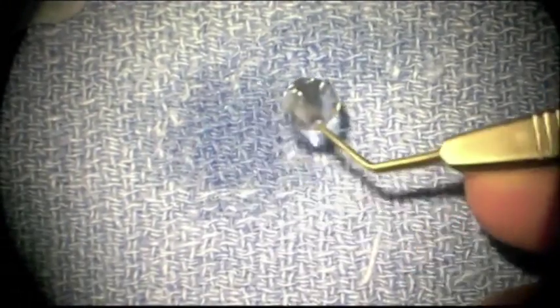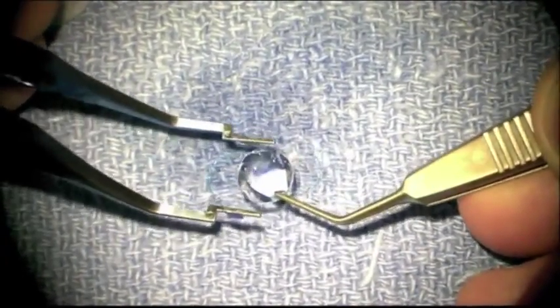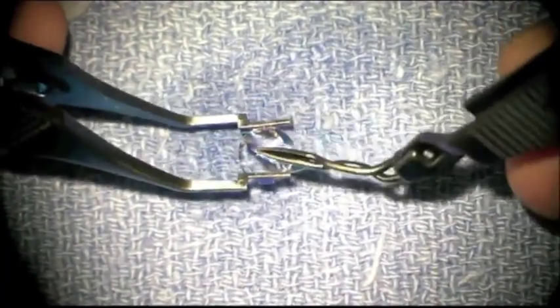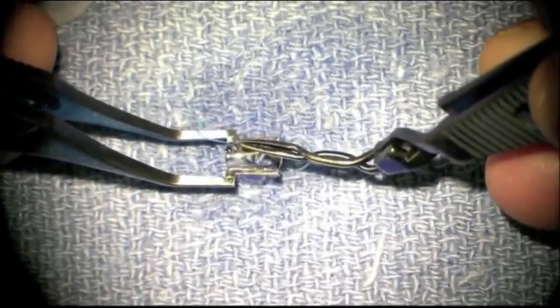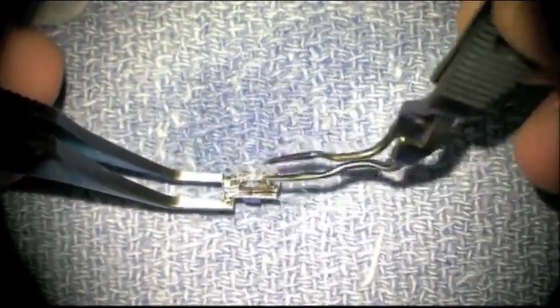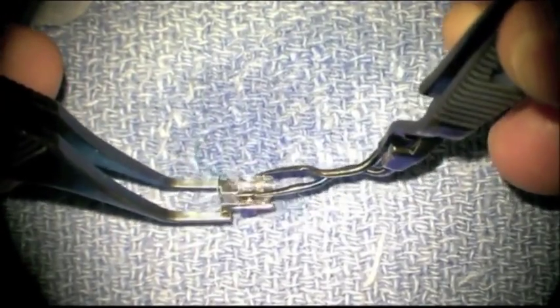As you can see, the haptics are in a backwards S configuration. Use these forceps that have the little tabs to grasp the edge of the optic. Then gently push the forceps together and it will fold the intraocular lens in half. Then use the second forceps to re-grasp the intraocular lens.